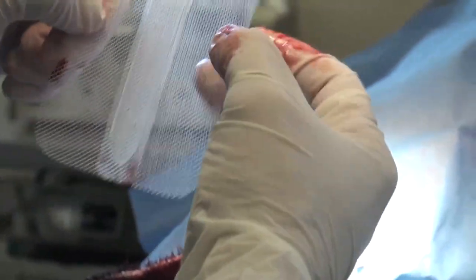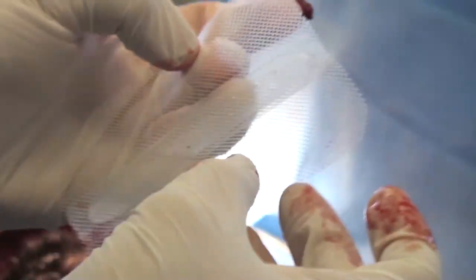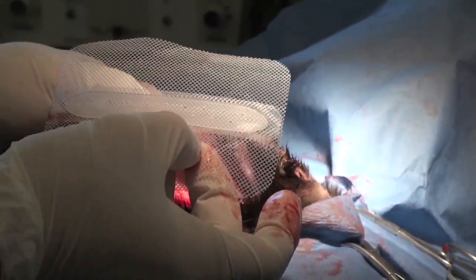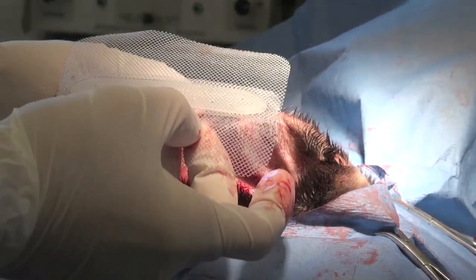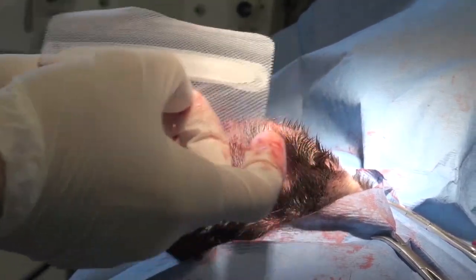We remove all this tissue to accommodate this implant. Obviously you have to trim it to fit in the ear, but the idea is to leave as much mesh as possible, because the fibrin is then going to cement the implant in position and it won't be moving anywhere.